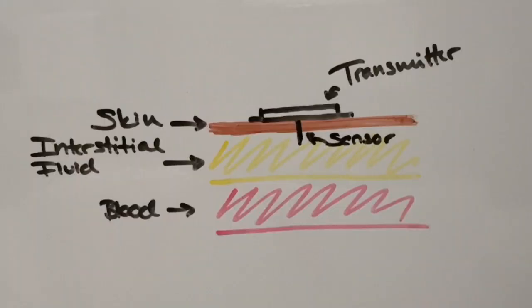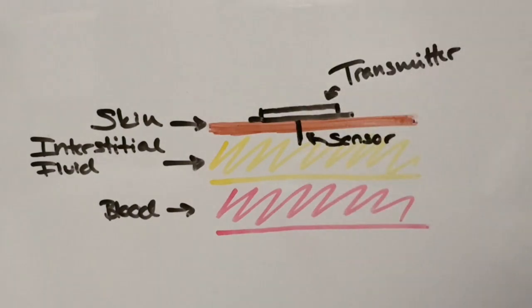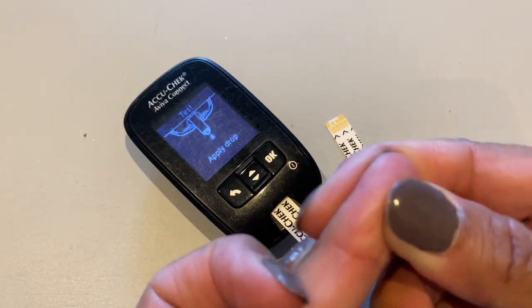It might seem straightforward. So if your glucometer and your Dexcom readings aren't the same, it's inaccurate, right? Well, not quite. Your Dexcom, like any other CGM, measures your blood sugars in the fluid underneath your skin, whereas a glucometer measures in your blood. The thing is, the fluid can be 5 to 10 minutes behind what's going on in your bloodstream. That means that your glucometer and your CGM can be showing different blood sugar readings without either of those readings being wrong. However, they should be fairly close. And shortly I'll do a deep dive into how close they need to be considered accurate.